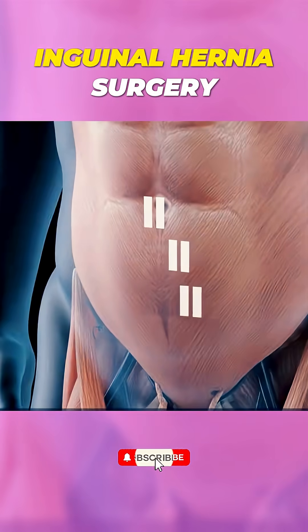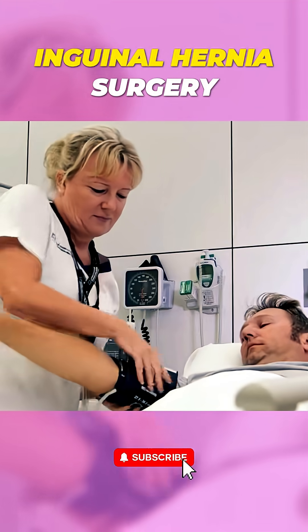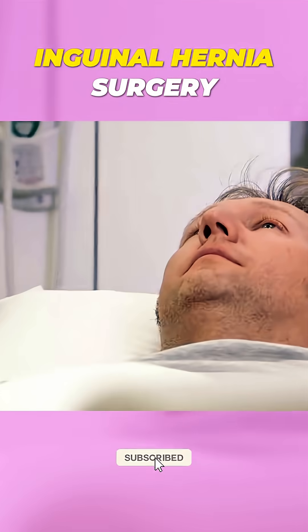And that's how inguinal hernia surgery is performed — either open or laparoscopic — both safe and effective.